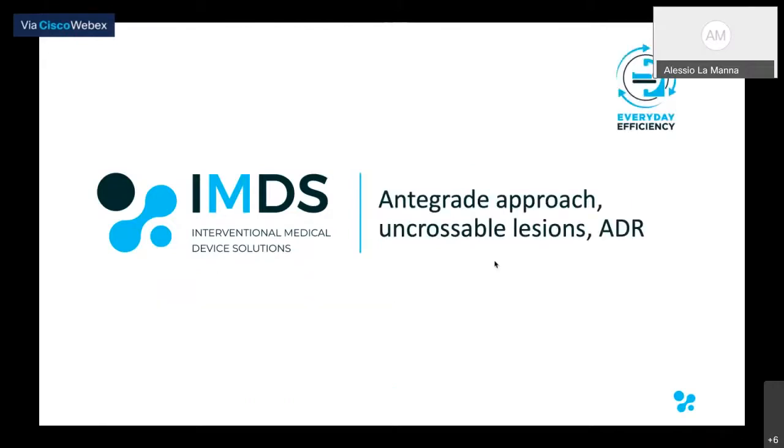We know that CTOs are still the main obstacle for interventional cardiology in order to get a complete revascularization. Since CTOs are relatively frequent, we know that around 20% of patients undergoing coronary angiography have CTOs. It's very important that modern, advanced operators are trained in order to perform this complex PCI.